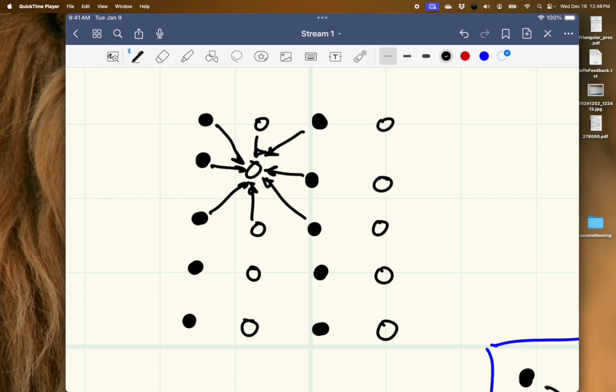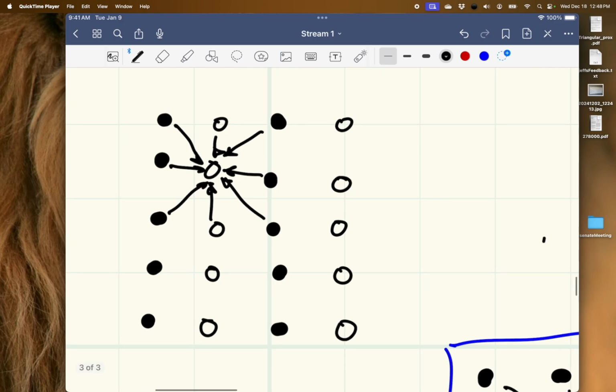And it's going to say, so it's going to do the interpolation here at this point with these unknown values, but it's also going to do, well, I'll draw this in blue. It's also going to do the interpolation here, for example, for the known value. And all it's going to say is, it's going to take each of these equations for each k-space location.